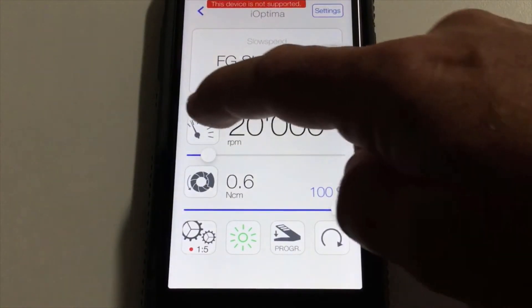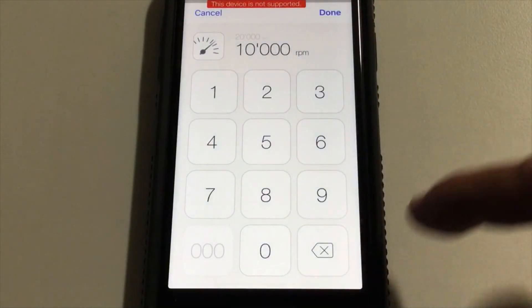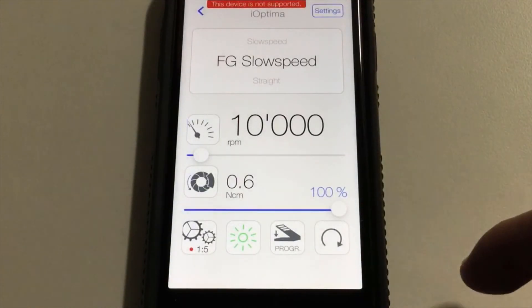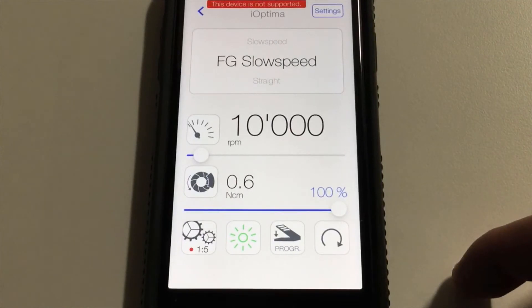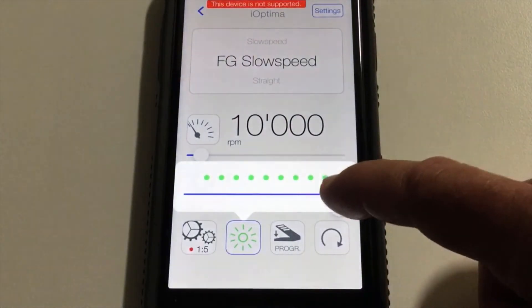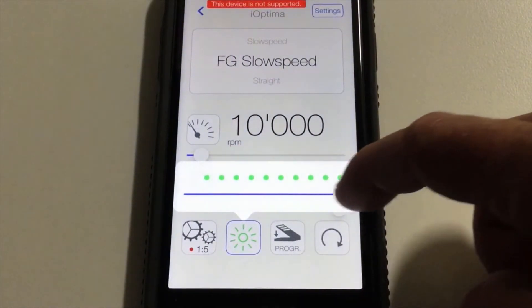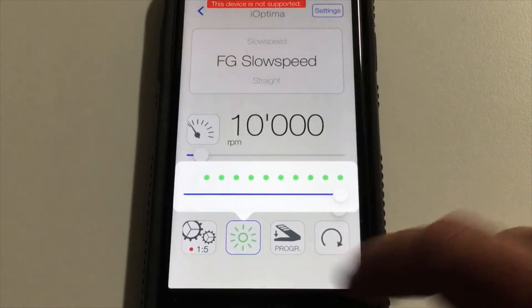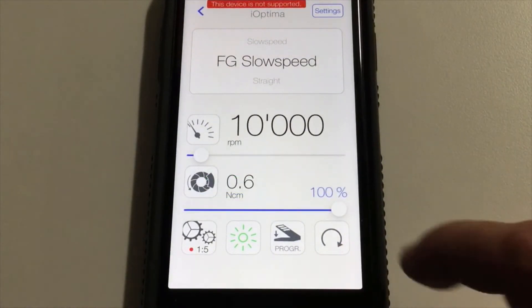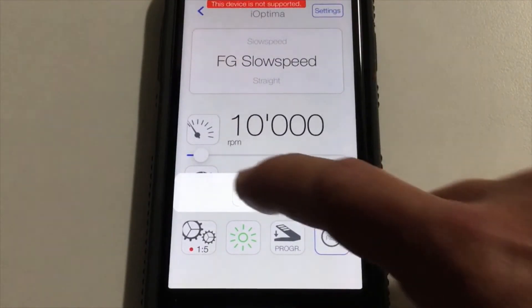Here, I would have the ability to change the program if I wanted to do so. If I wanted to adjust my fiber optics so I could control the amount of light coming out of the unit, I could do that here. I would also have the ability to forward and reverse the motor if required.